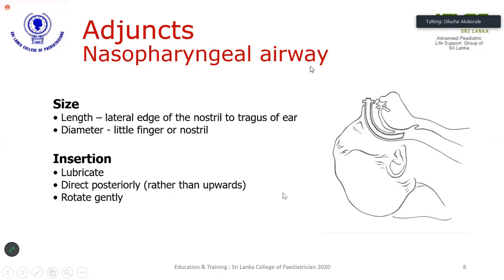Nasopharyngeal airway insertion is a little cumbersome procedure and might be uncomfortable for the patient. So before insertion, you need to lubricate it well, and then, as shown on the picture, direct it posteriorly rather than upwards, and slowly insert it along the nasopharynx.